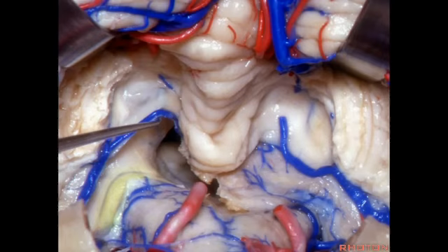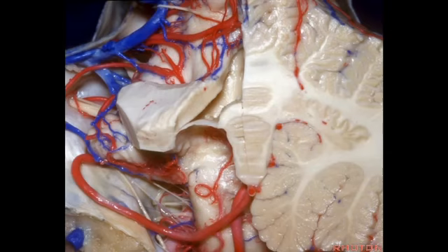Does anyone know what this is? That's dorsocochlear nucleus. They actually put the brainstem implant in the lateral recess. Just below this is ventrocochlear nucleus, and I think they try to set it right on the junction of the two. Some people do it from lateral through Luschka. Yeah. If the brainstem is real distorted with a tumor, I know some people come back down here and lift up the tonsil and open the lateral recess and stick it in from below if the brainstem is real distorted. Here we just see a view of all of this area.